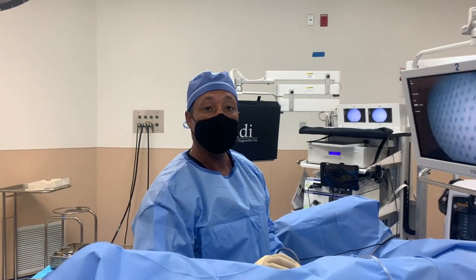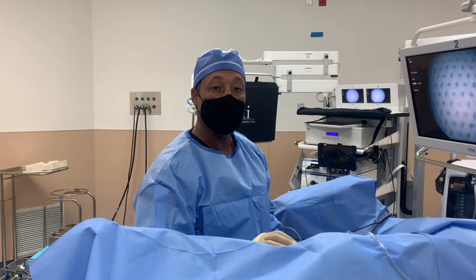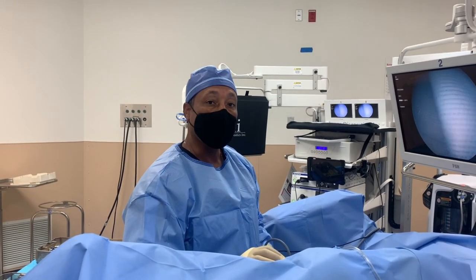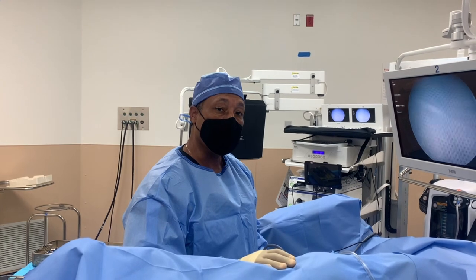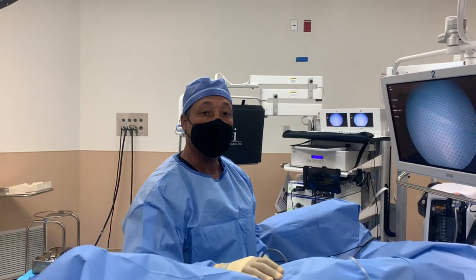Dr. Hallowell from Z-Urology. We're going to be performing today the first I-10 procedure in the state of Florida. So I'm going to do a new minimally invasive procedure. We're going to demonstrate how the procedure is done today and we'll go from there.